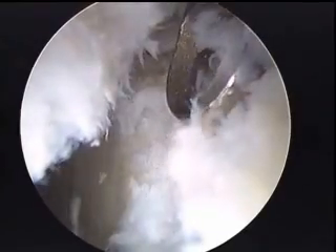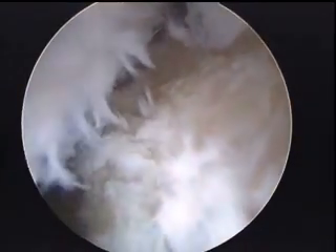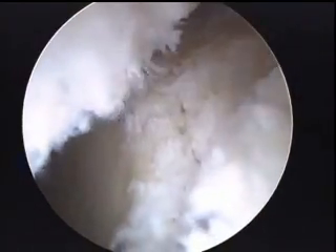As you can see, this is quite an extensive tear. If we're looking at a clock face of the cup, this tear is essentially going from an 11 o'clock position over to a 3 o'clock position, and here we're continuing to clean up this area now with a shaver.